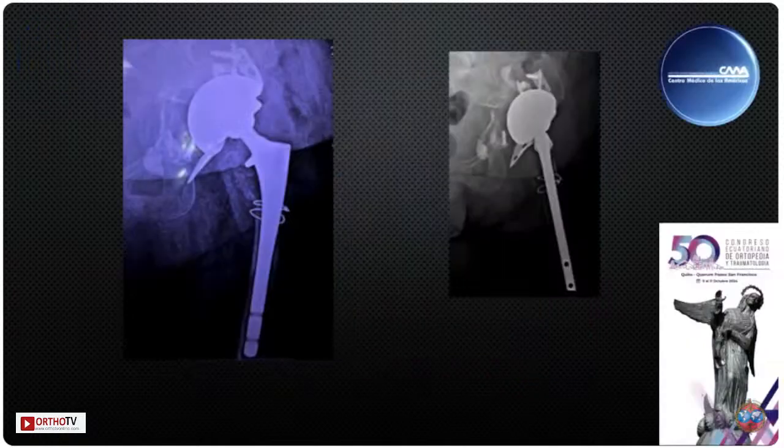In this area, everything is refilled with allograft, mixed with the cup cage. It was very difficult, and it was not possible to lower the rotational center, but there was a stable fixation of the stem and the acetabular cup.